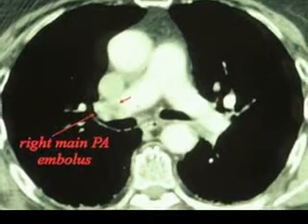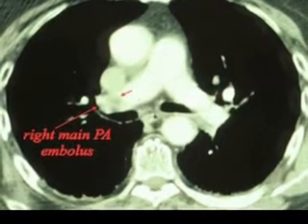How does a CT angiogram work? A CT angiogram is performed following the injection of an iodinated contrast agent into the veins of the body, and we watch the blood flow through the various blood vessels depending on when that iodine dye reaches those blood vessels.